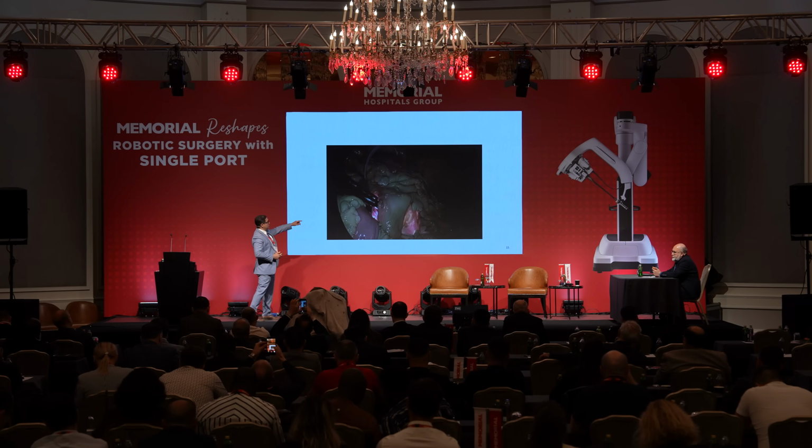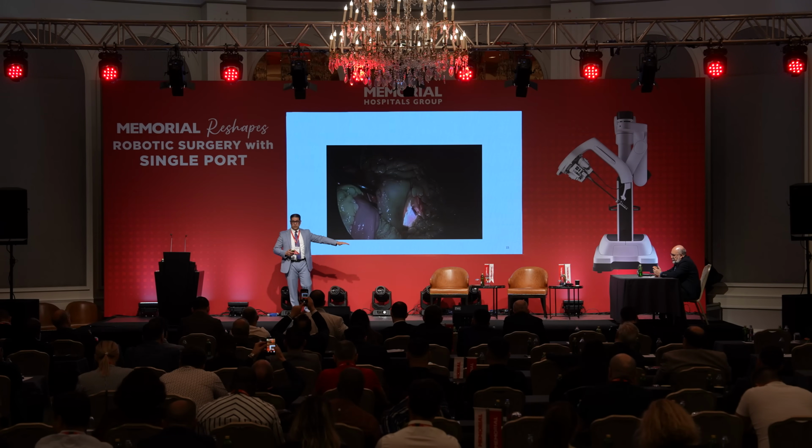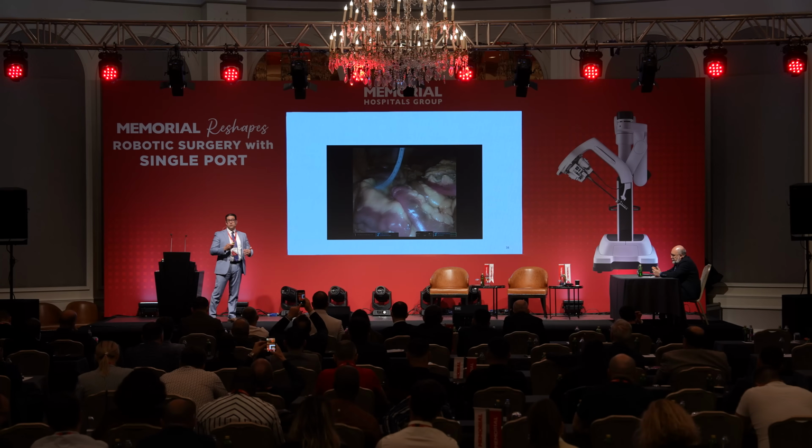But as you can see here, I already entered my tunnel, and I dropped the duodenum down, and I'm doing the procedure the way I want it. I am happy to share any of my videos with anyone for educational purposes, okay?